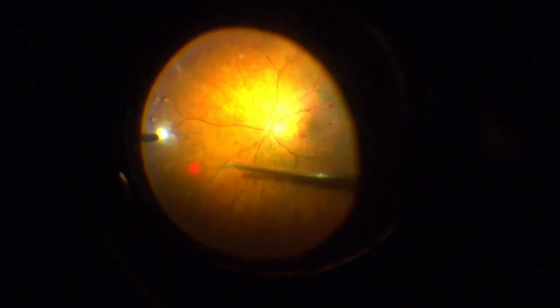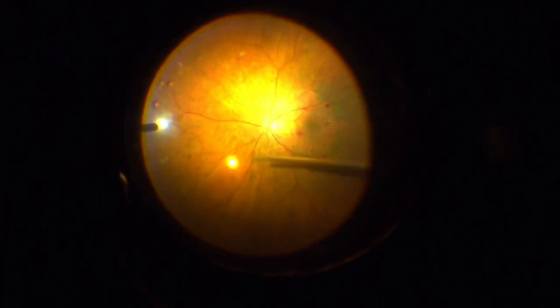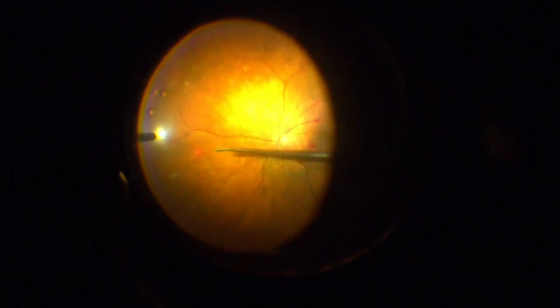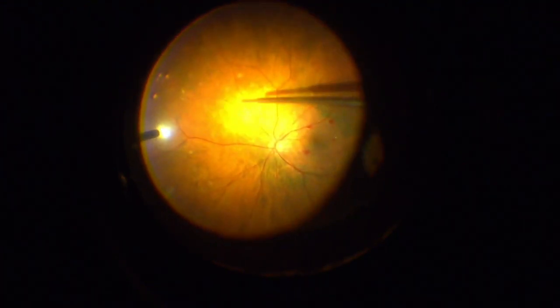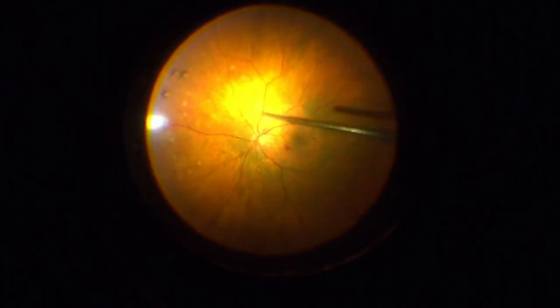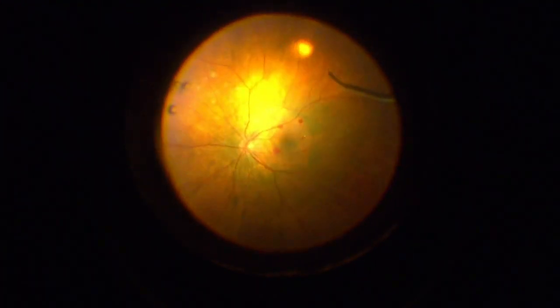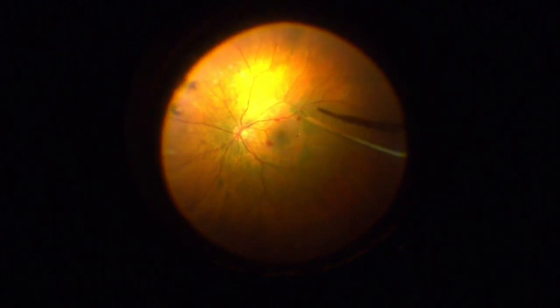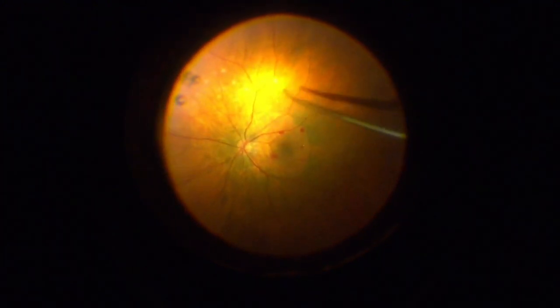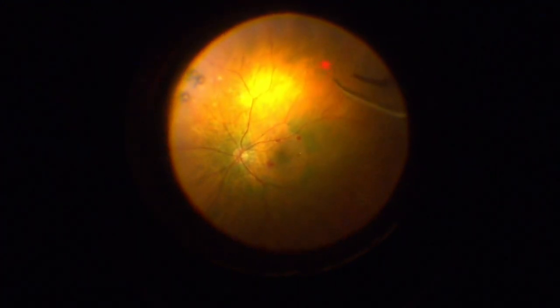And you know, we're just going to scatter some light PRP around here. Doesn't have to be real symmetrical. You're just trying to get some peripheral laser in. What this does in the eye, obviously, is it treats areas of retinal ischemia, which lowers the amount of VEGF being created in the eye. Vascular endothelial growth factor levels drop. Then I need less of the Eylea injections, which are anti-vascular growth factors.